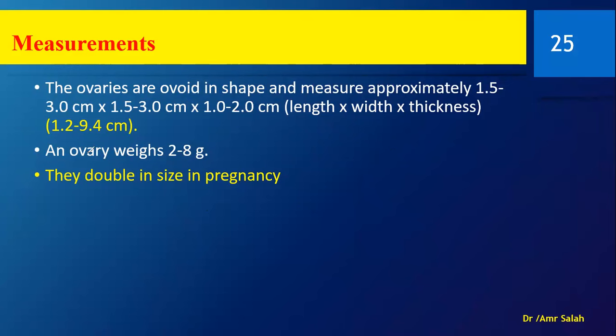Okay, what are the measurements here for the ovary? Well, there is a very important dimension here. That is, it has not to increase 5 centimeters in any dimension. Now, this is an important figure here. Okay, 5 centimeters. There is another figure that is 10 cc, its volume.